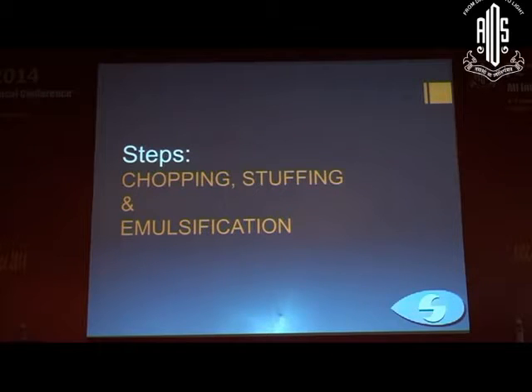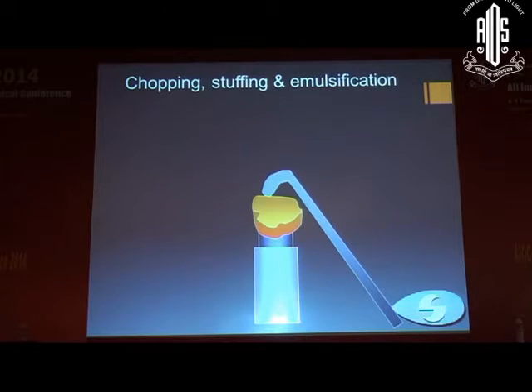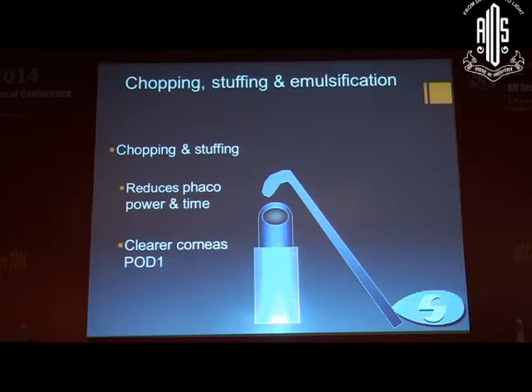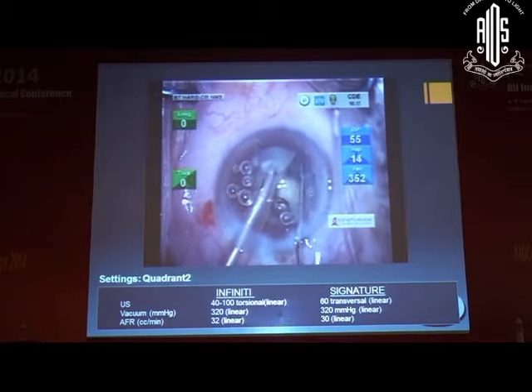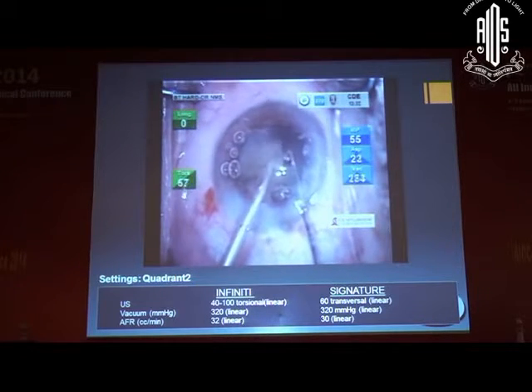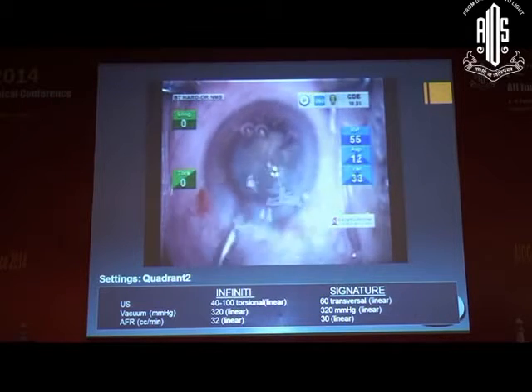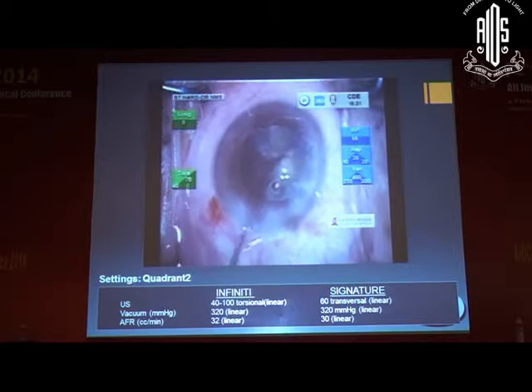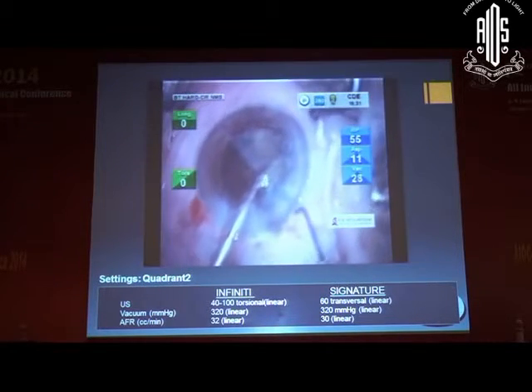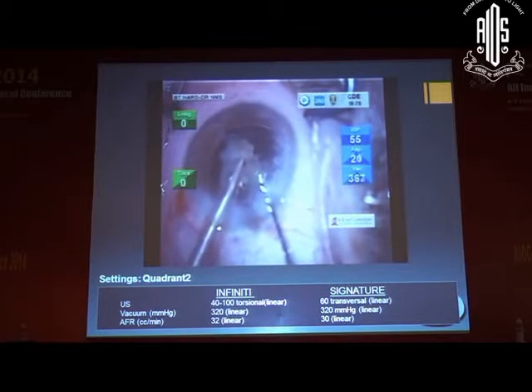Now the chopping and stuffing technique: the quadrants are chopped into smaller pieces and stuffed into the phaco tip. Chopping and stuffing reduces phaco power and time, and you get clear corneas on the first post-operative day. Each quadrant is taken up, chopped further into two, and emulsified. During chopping you require more vacuum, but during emulsification you require less vacuum. As the bag becomes more bare, reduce the vacuum and flow rate so the posterior capsule does not get drawn into the tip.